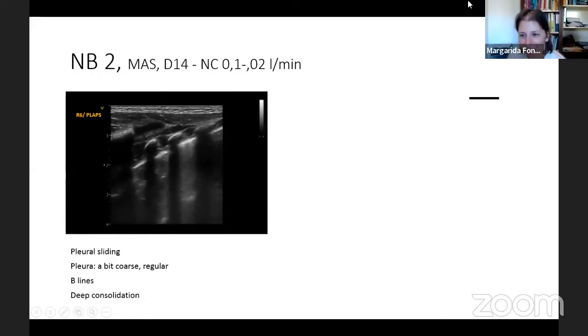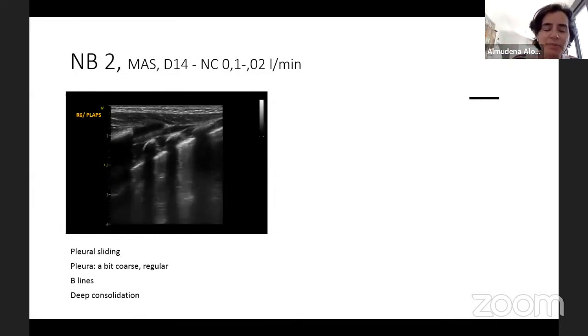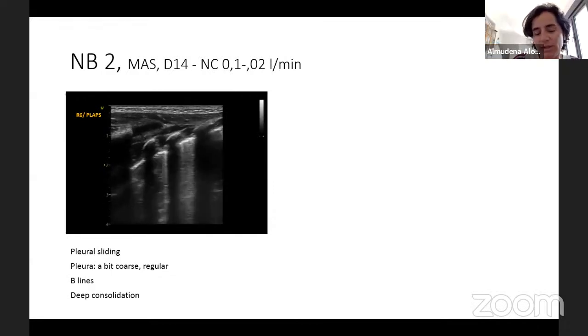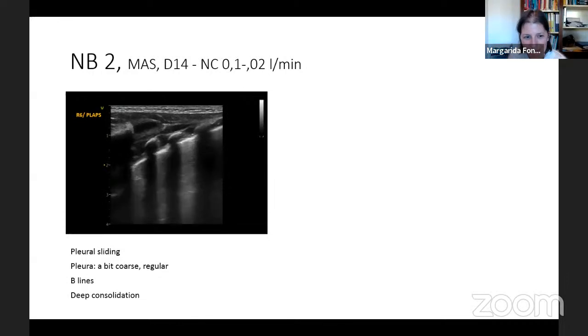Because if you see the pleural line, it means that you have two spaces or two fields with different acoustic impedance. So you have the impedance of the water, which is the subcutaneous tissue or whatever you have there, and then you have air, and this is why you have the pleural line drawn there, because you have a difference between two tissues with different acoustic impedance. This is why all echoes are reflected, and then the machine draws the pleural line. So that means that you have air there, with a bit of water or some inflammation, but you have mostly air. So you cannot have a consolidation.